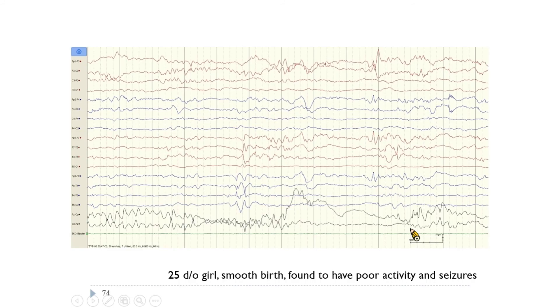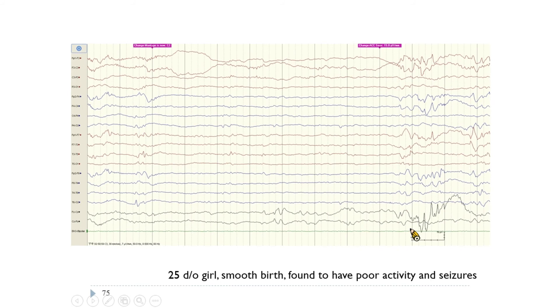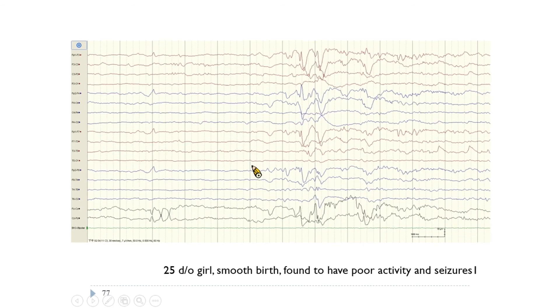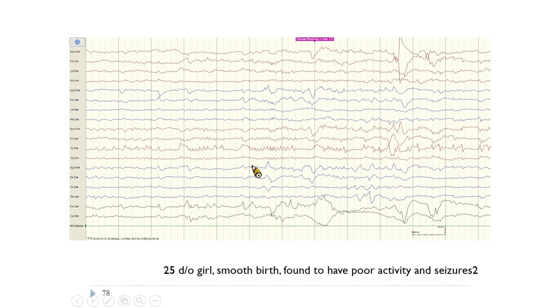This is a 25-day-old girl with an uncomplicated birth, found to have poor activity and seizures for one day. EEG demonstrated multifocal spikes, at times with periods of electrodecrement for seconds. You can see a brief rhythmic low-amplitude fast activity for two seconds in the left temporal area. The next six consecutive pages show an unusual abnormal background with some rhythmic discharges from the left temporal area, building up in frequency, then becoming periodic.